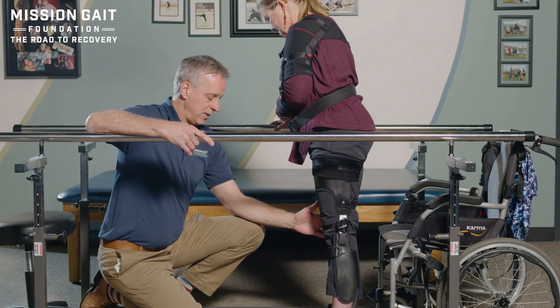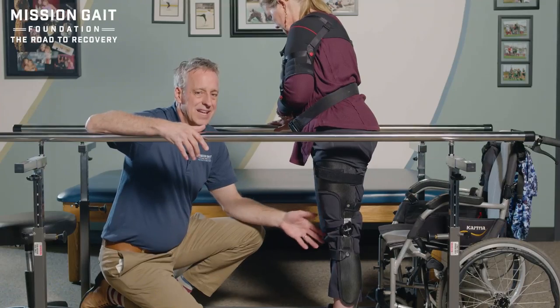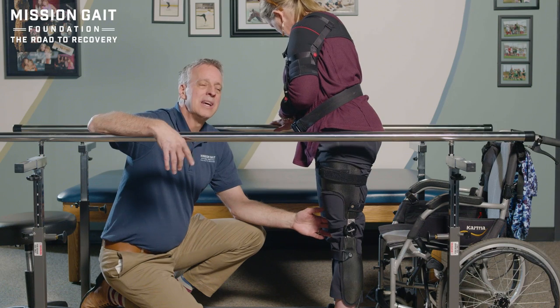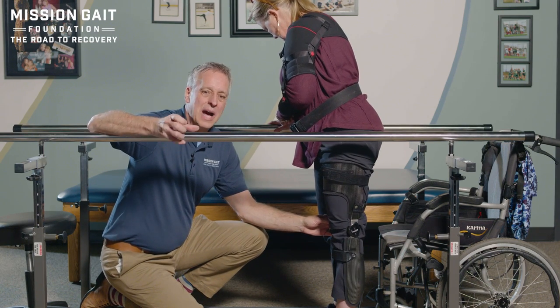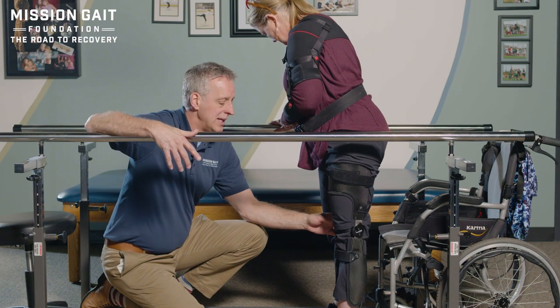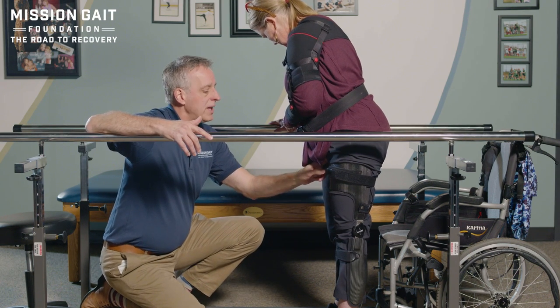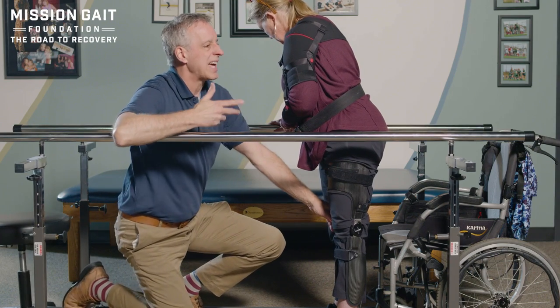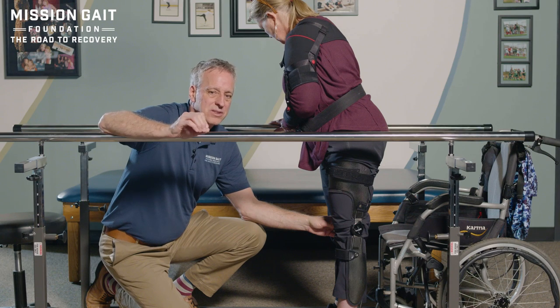Keep weight shifting back and forth, Eleanor. As she's going, I'll talk to her about things she should or should not be thinking about with this brace. For example, a wearing schedule. You don't put a brace like this on and just wear it all day. You want to put it on for a couple of hours at a time, then an hour off to check it, and then add about an hour every other day of wearing time. This ensures that wherever it's rubbing or there's a problem, you don't create a bigger problem before you get it adjusted. Adjustments are exactly right, because how she is loading it the first day versus weeks later will change. The device may be comfortable on day one but very uncomfortable a week later — pinching up into the groin area, pinching around the knee, someplace where it's catching. That's not anything wrong with the brace; it means she's putting more pressure on it than before, and now we need to adapt. So there's always a communication with our orthotic friends to ask: can we make an adjustment? Can we get this adapted to fit her a little bit better?